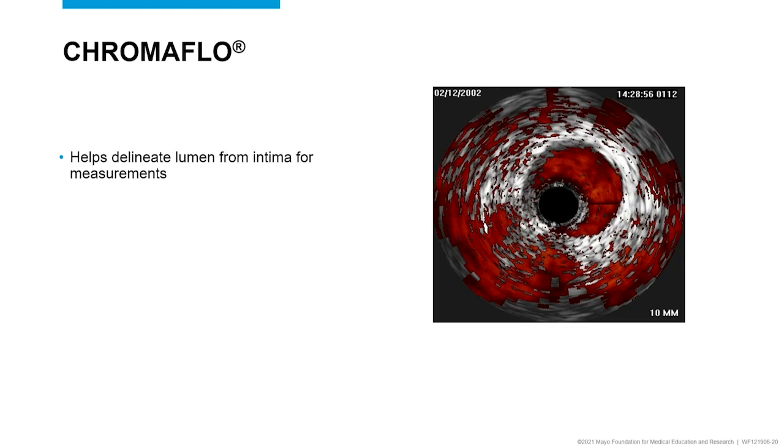It's a very useful feature, especially for certain types of interventions when you're trying to see if you're getting into a true lumen or not, where you really are in a coronary or even in a peripheral. It's a very useful tool to have.